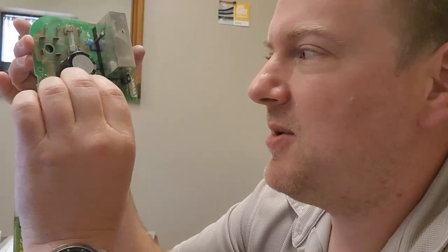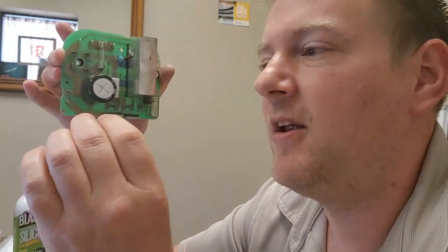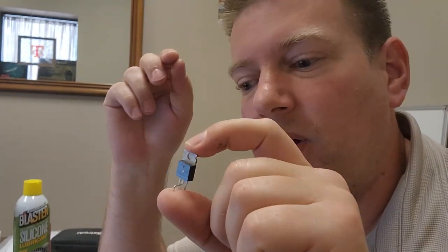So what was happening is I could hear the SCRs buzzing. So that tells me that they're running absolutely fine. But one leg of this guy, two of the legs were actually showing a voltage drop. The other one was showing that it was shorted. And let me go ahead and show you guys that right here on my desk with a multimeter. So it's not just theory. I can show you exactly how the failure happened.